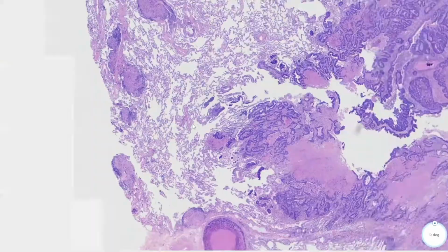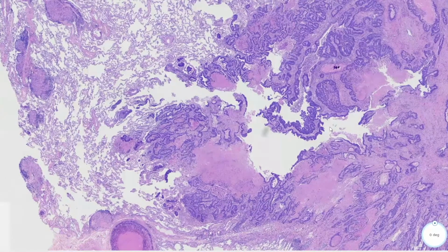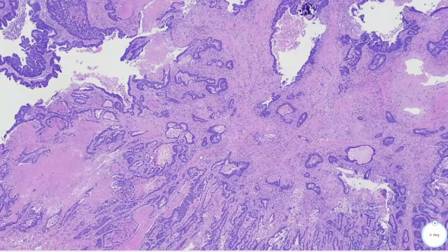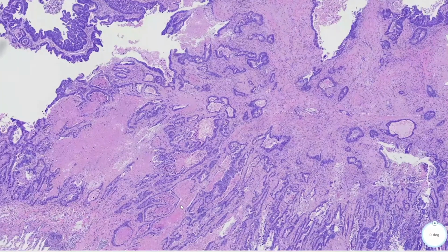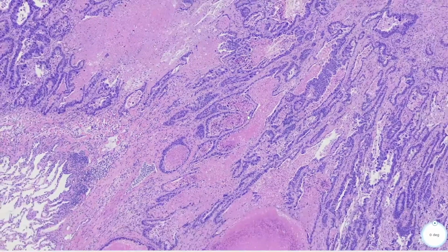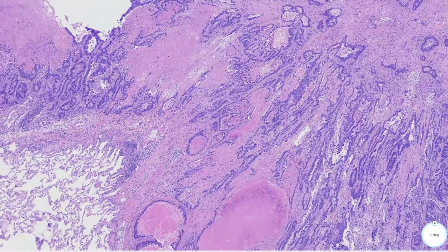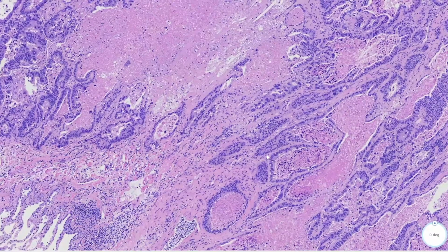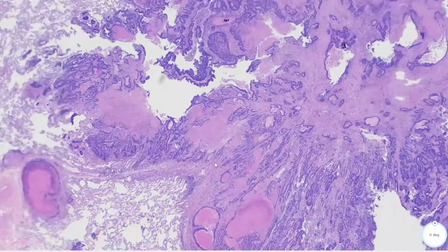So that's our first case. It's a metastatic colorectal carcinoma that shows this infiltration of complex glandular structures with a desmoplastic stromal reaction. It has this intraluminal necrosis, or dirty necrosis, of the cells. An important point to remember is that the immunophenotype for this can lead you to think about colorectal cancer. It's not completely specific, as a subset of lung carcinomas can also be positive for CDX2 with a more enteric immunophenotype.